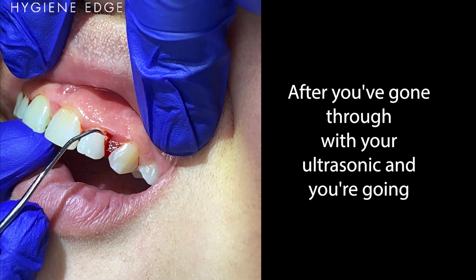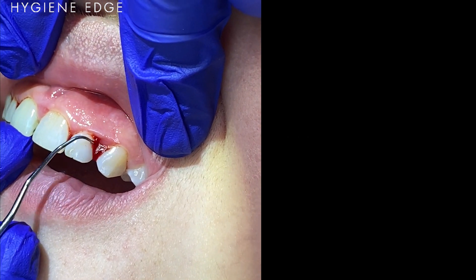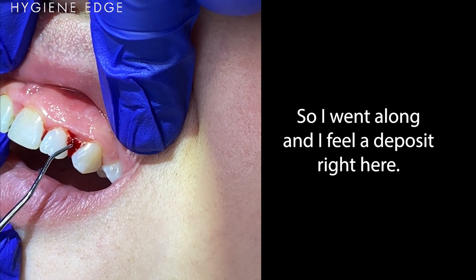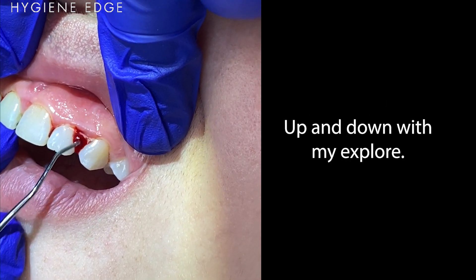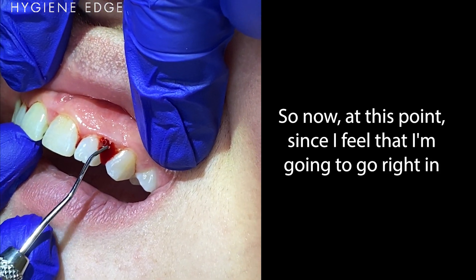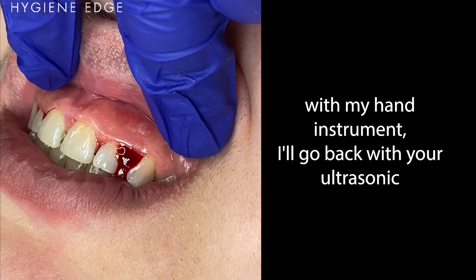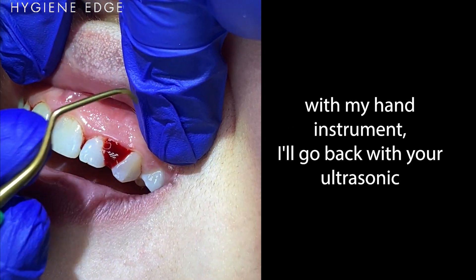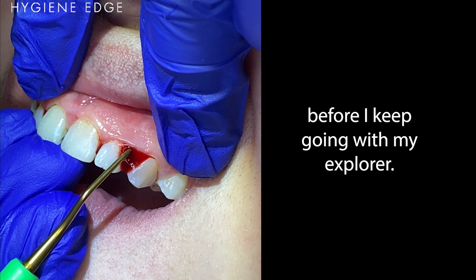After you've gone through with your ultrasonic and you're checking with your instruments, I went along and I feel a deposit right here. Up and down with my Explorer, I can feel a jump both ways and it feels a little bit rough. So at this point since I feel that, I'm gonna go right in with my hand instrument, or go back with your ultrasonic and do some strokes before I keep going with my Explorer.